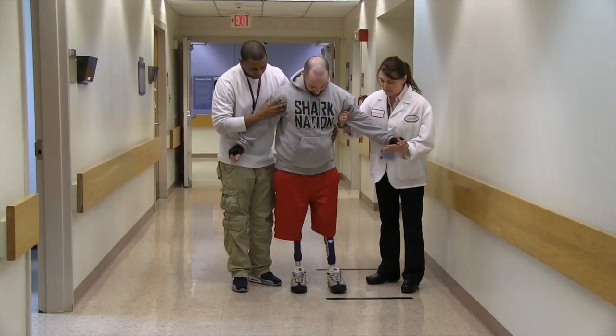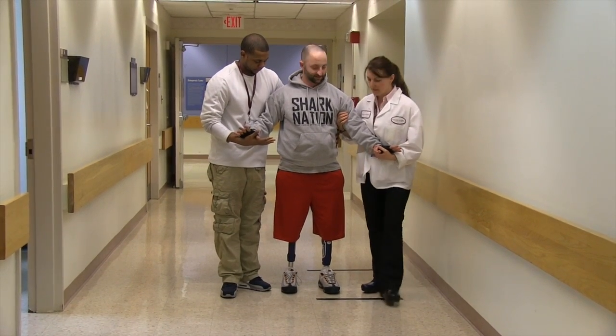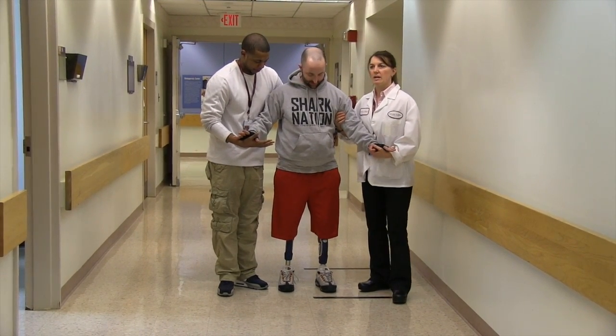And left leg, really concentrate. Left leg goes out more, okay? And walk.